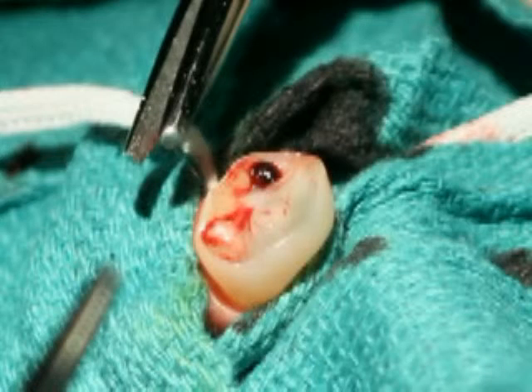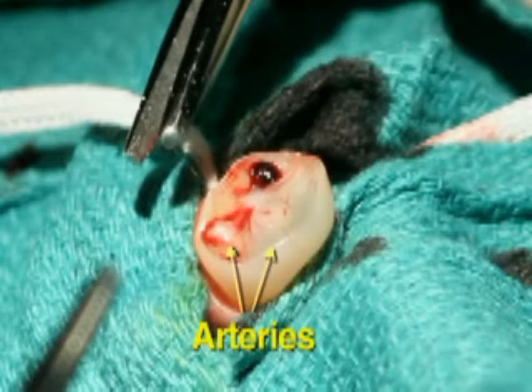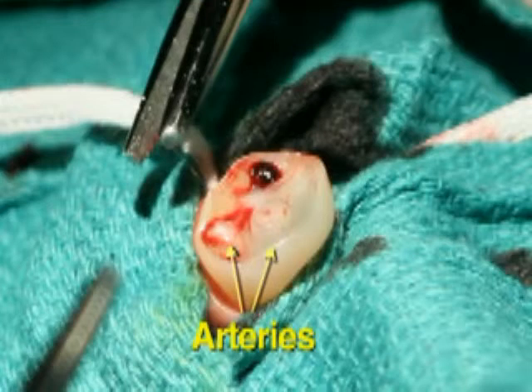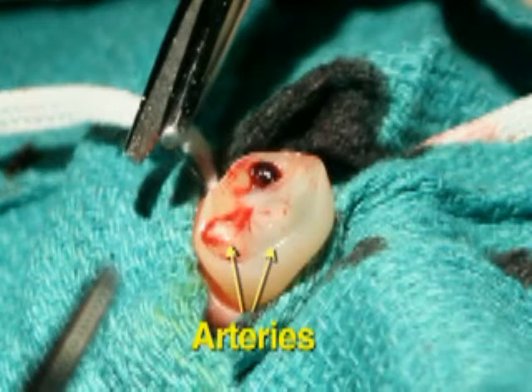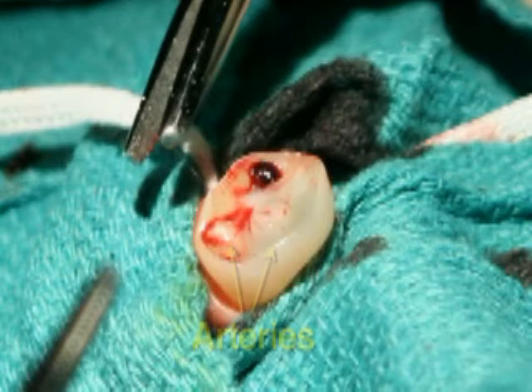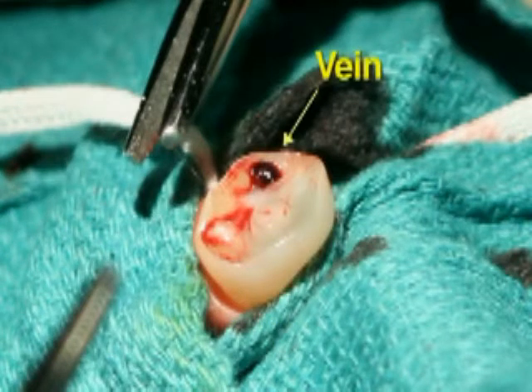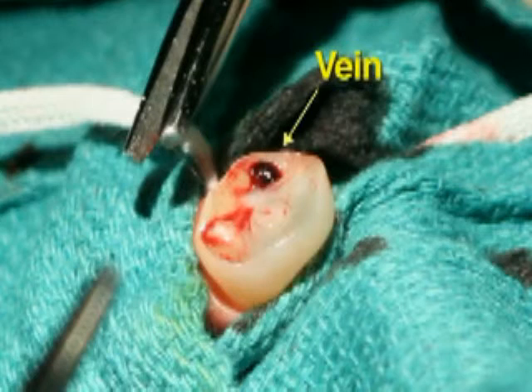Within the Wharton's jelly of the umbilical cord, the arteries are located lateral of the midline vein in the inferior portion of the cord, at positions 5 and 7 on the face of a clock. In a full-term infant, the artery is approximately 7 centimeters from the umbilicus to where it joins the internal iliac artery. The umbilical vein is a larger midline vessel with thinner walls, located at position 12 on the face of a clock.